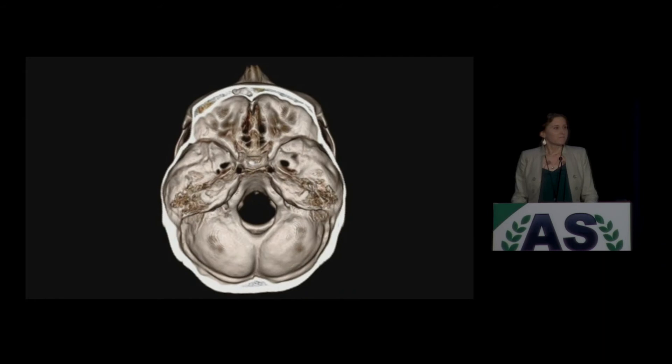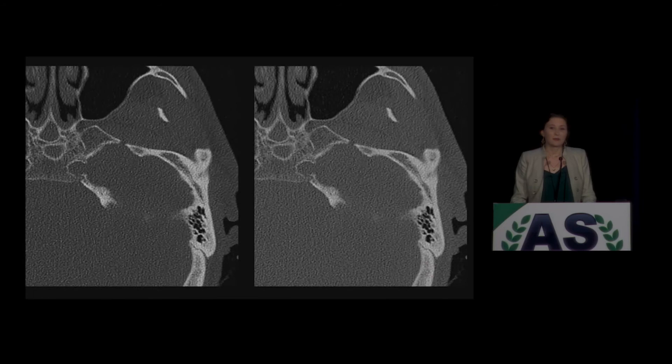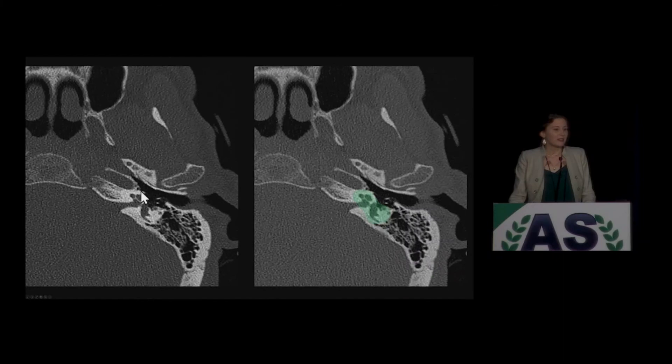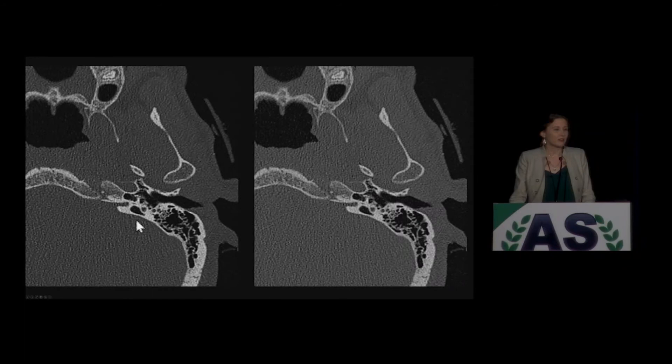What I have here is a 3D image of the skull viewed from above. I'm going to window this down in my 3D reconstruction software until all the thinner bone starts to disappear — fading away until only the really dense bone is left behind. If I window it all the way down, what I'm left with is these two structures right here. This is the otic capsule on both sides. This is the densest bone in the human body — really, really dense — which gives us an awesome way to find these on CT. This is the same image twice; on one side I have highlighted the otic capsule. It is like a shining white beacon glaring at you, sitting in the middle of the temporal bone. You can see all the edges of it. This little curly thing happens to be a semicircular canal — it doesn't even matter, though. If it's got this really dense bright white stuff around it, that is the otic capsule.